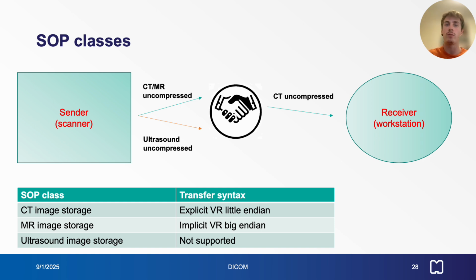Manufacturers provide DICOM conformance statements that list supported SOP classes and transfer syntaxes. Comparing these statements during purchase or installation is critical for ensuring interoperability. Devices or software involved in DICOM communication are referred to as application entities, which facilitate the association and data exchange processes.